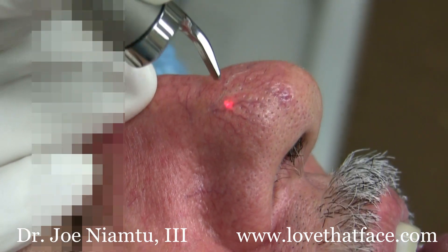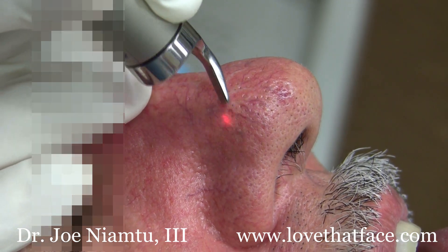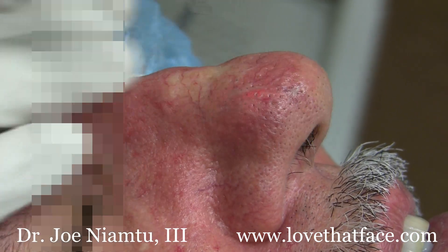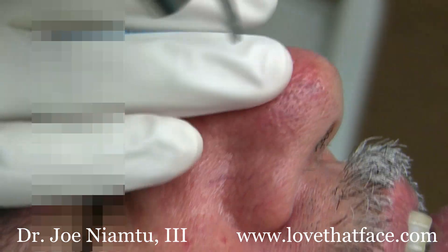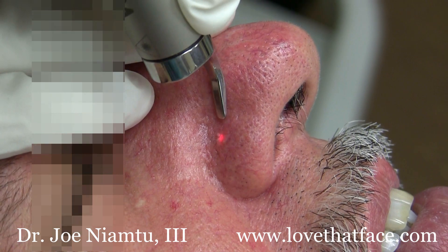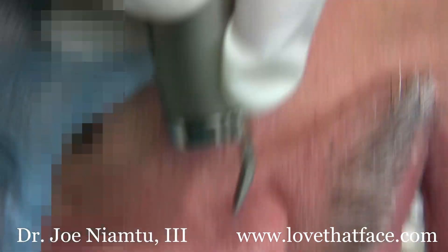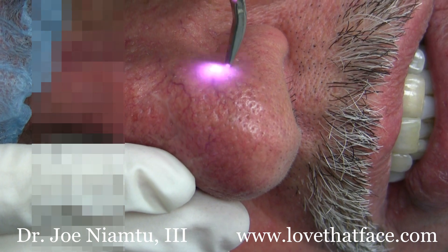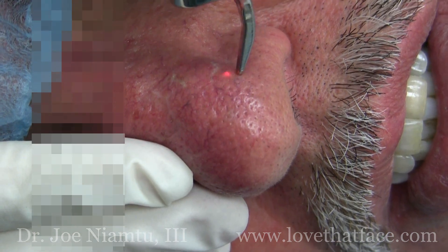You can see the spider veins just disappear as we treat them. We usually do this under just topical anesthesia, but this patient today is having some other procedures so he's sedated, which makes it a lot easier. You can see how easy this is with the 940 laser.